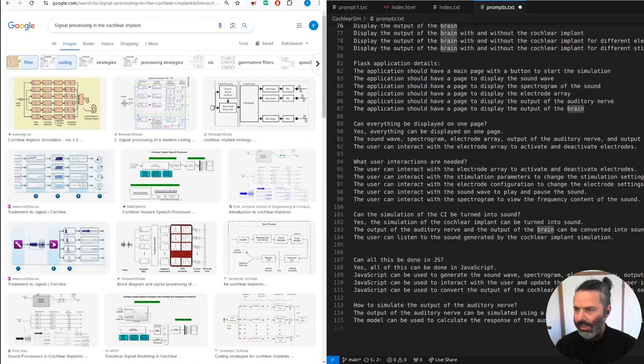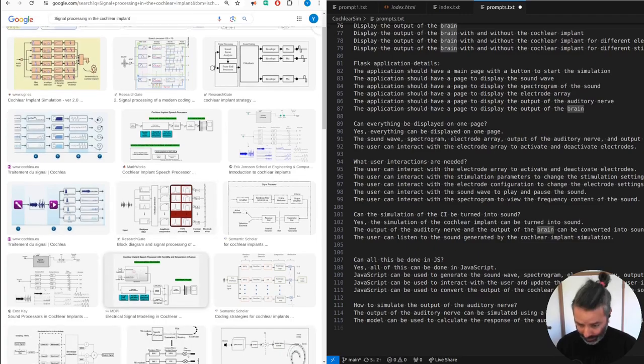Jump straight into development. We want to do a simulation of a cochlear implant. This particularly will focus on the signal processing part. It will be something similar to that, but interactive.